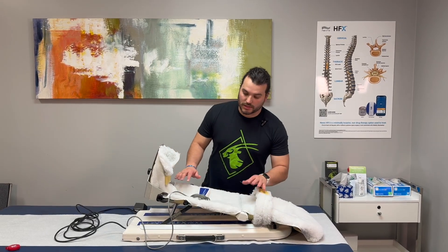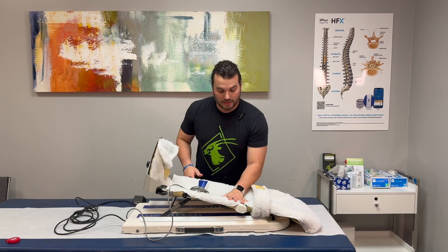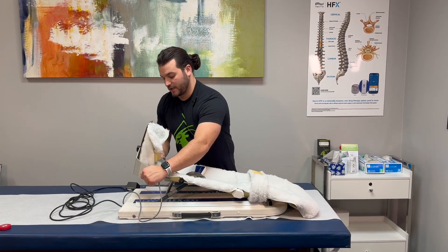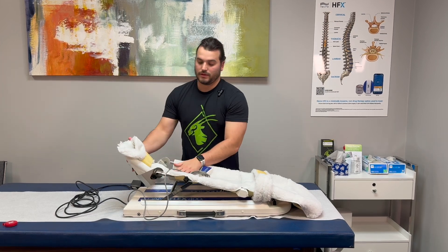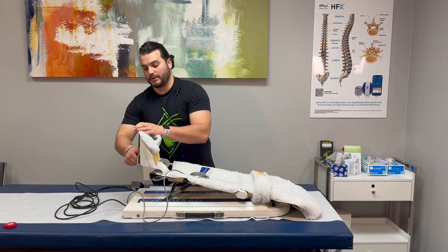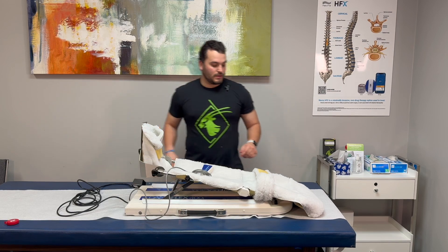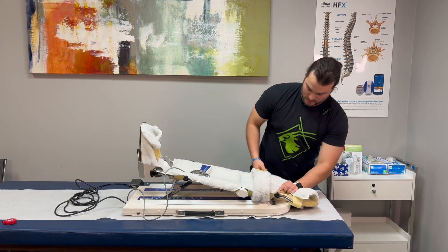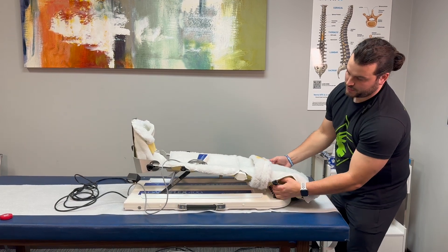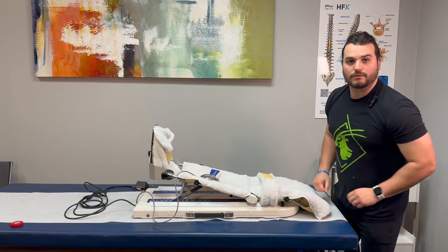Now we're going to go over the adjustments for this CPM — just like the previous one. The knobs for leg length adjustment are right here closer to the hinges part of the knee brace; they extend and shorten. You also have knobs here to help with dorsal flexion and plantar flexion, set to whatever is most comfortable. There is also a knob that helps with the patient's inversion and eversion of the foot. The knobs on the side help with fitting patients who are shorter or taller into the machine. Those are the adjustments for our CPMs.